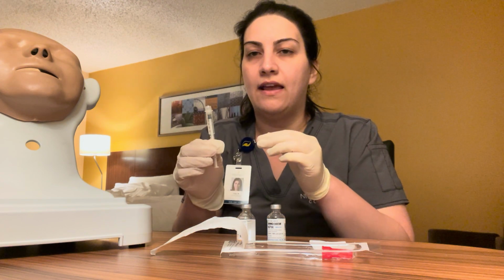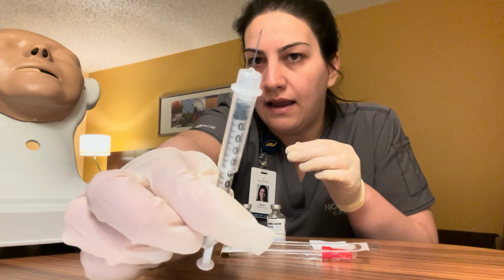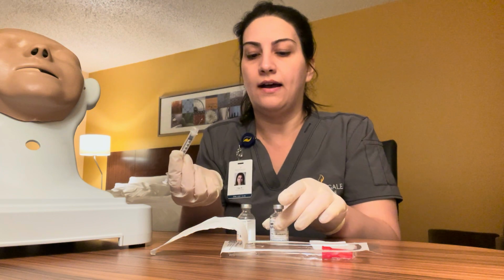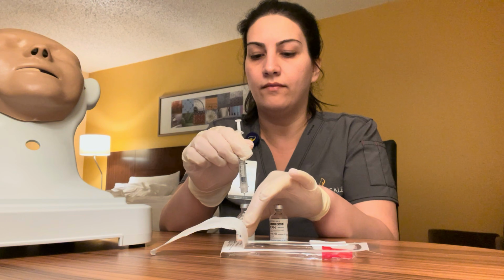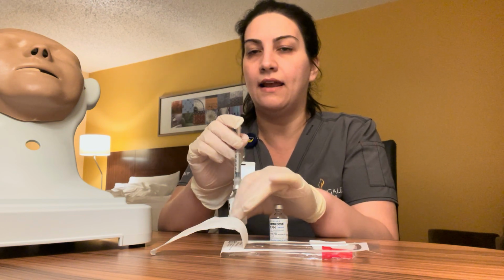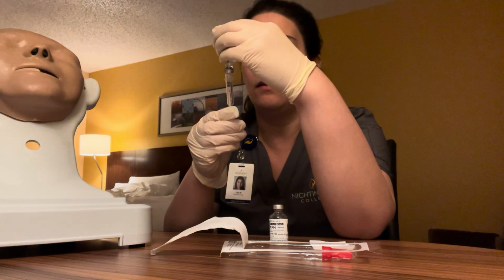Nurse and I verify against the MAR, 4 units of air. Next, we're going to inject the air into the regular, and now I'm able to tip it over and draw up the regular insulin.